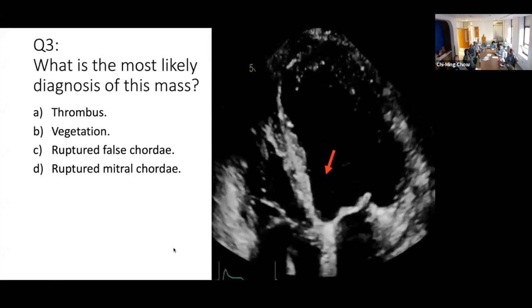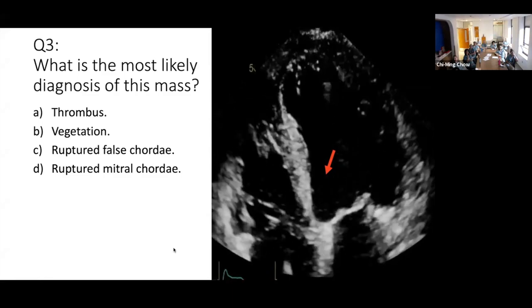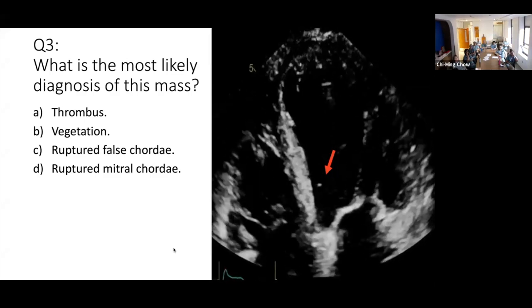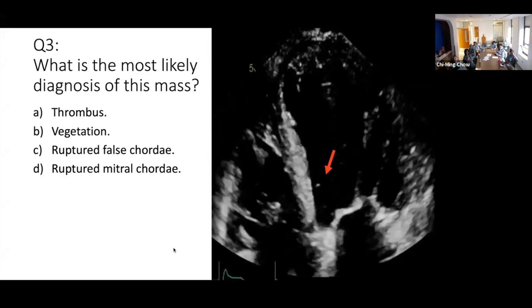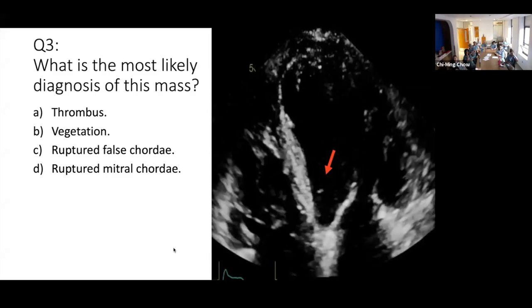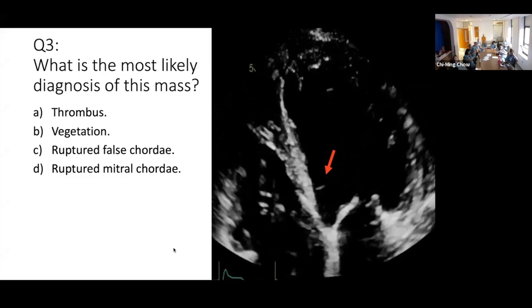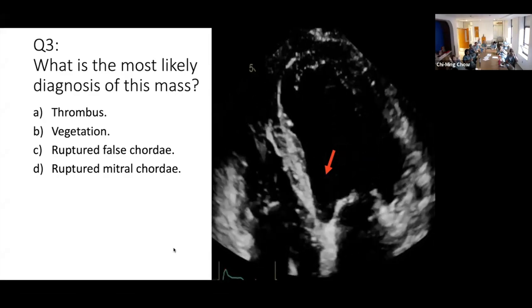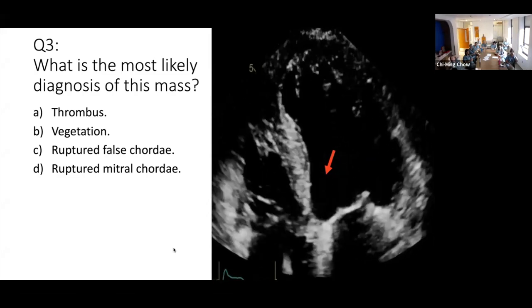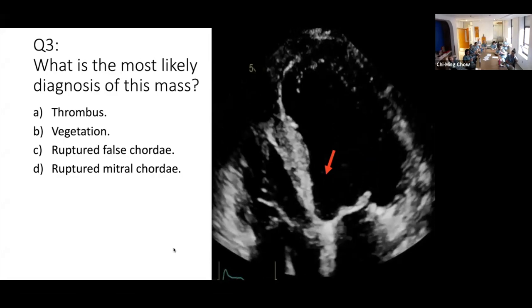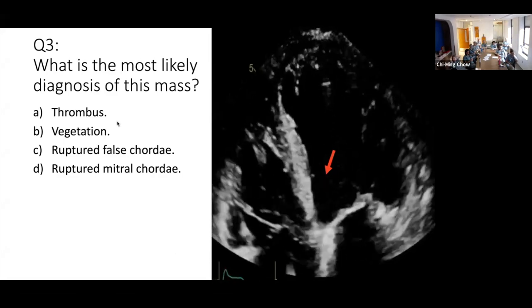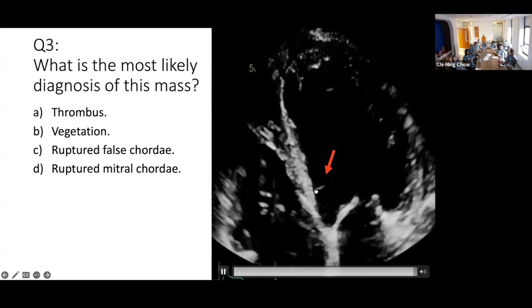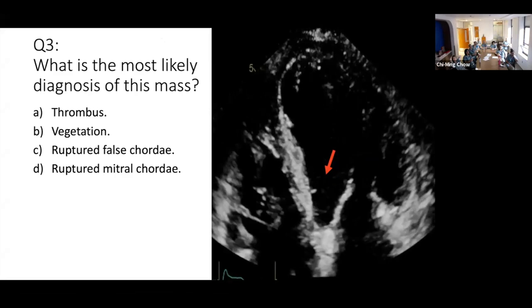What is this tiny mass on the side of the LVOT or the septum? Is it a thrombus? Is it a vegetation? Is it a ruptured chordae? Is it a ruptured papillary muscle chordae? 100% of respondents said it is a false chordae. Why is it a false chordae? Because of the site here — it is lying there.